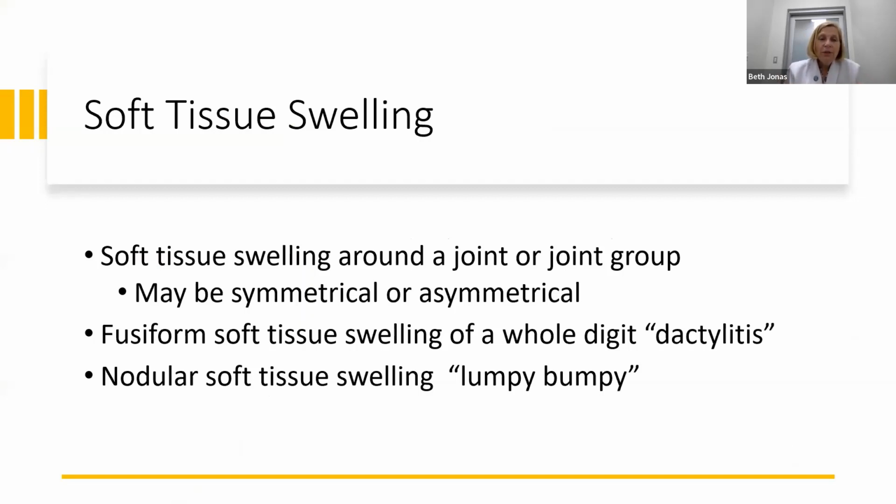So obviously you don't need an X-ray to know if there's soft tissue swelling. Hopefully you've seen that patient in your clinic and you've been able to really look at their joints in front of you. Although, as you know, swelling can come and go. So the patient may have had the X-ray 3 weeks ago when they had a lot of swelling, and then they come to you and they don't have swelling. So that happens. But if you have a contemporaneous physical exam and X-ray, you should be able to see that soft tissue swelling on your physical exam. But you're also going to be able to see it on the radiographs.